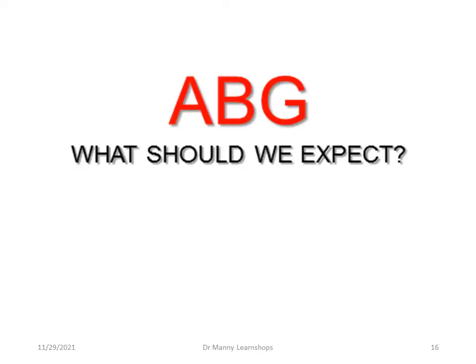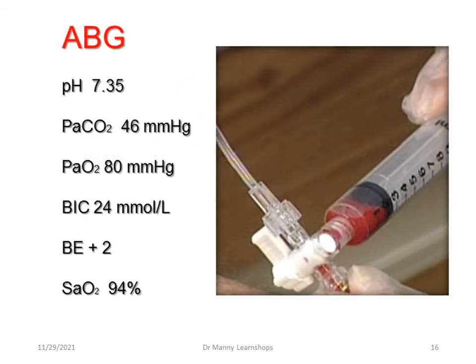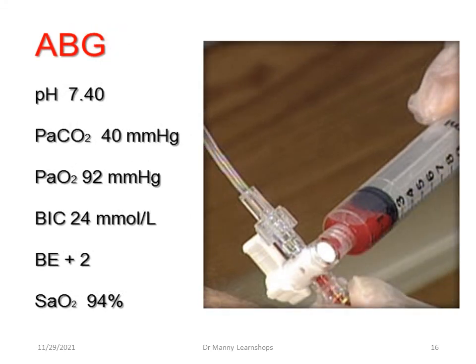Arterial blood gases, what should we expect? Well, we should expect them to be within a normal pH range, with a nearly normal PaCO2, a normal PaO2, hopefully normal acid base, and a saturation of at least 94%, between 94 and 100%. There we can see improving, PaO2 92, PaCO2 40, pH normal, saturations 94% normal.